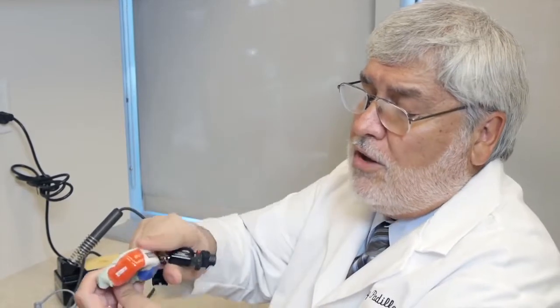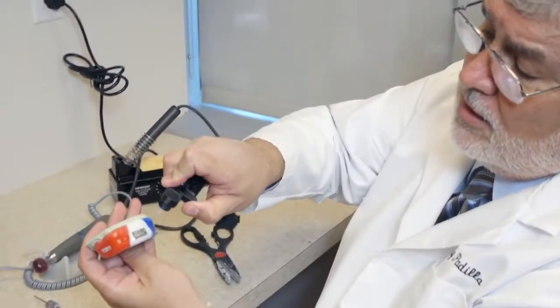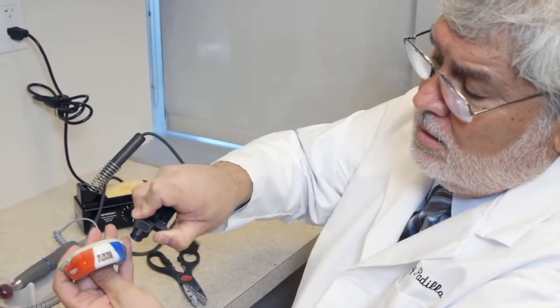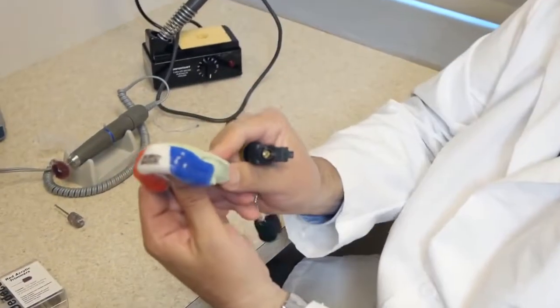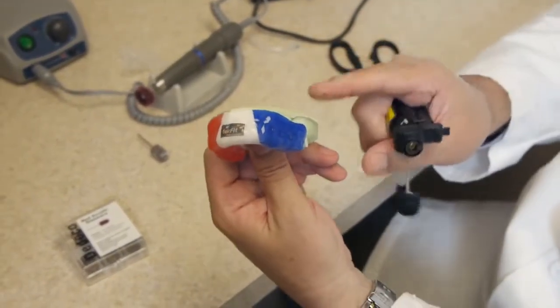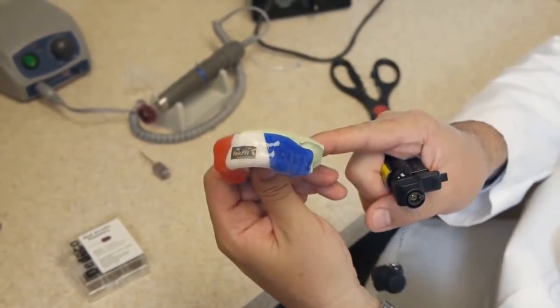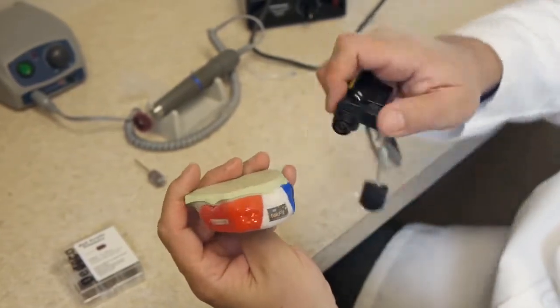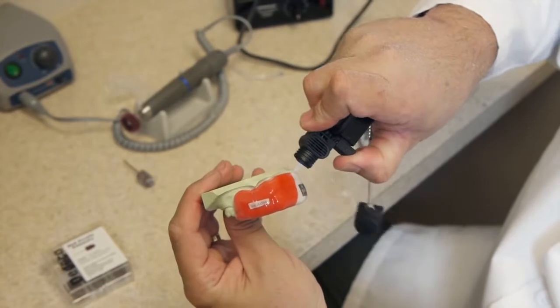You can use a polishing liquid by Dentsply, the eucalyptus oil, or you can use a torch to polish. So very gently go over the margins and polish them. There's your final polish. You want to make sure you don't do this too much because you don't want to distort the mouth guard. You do this all the way around.